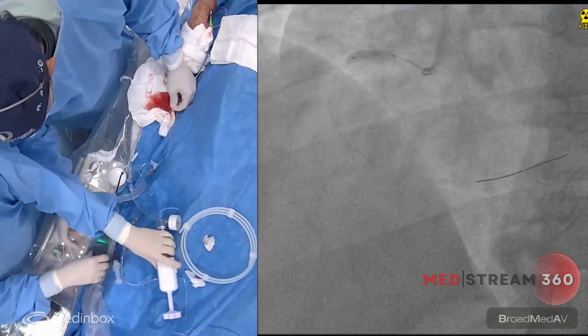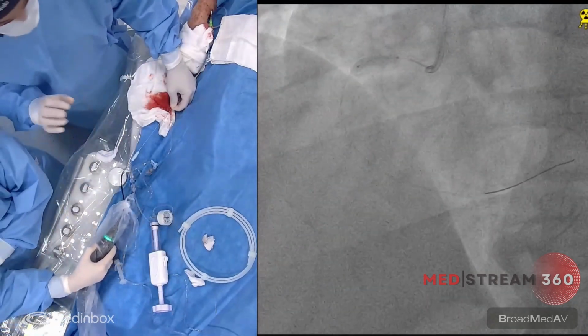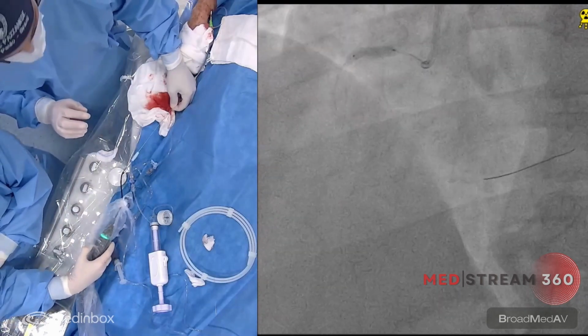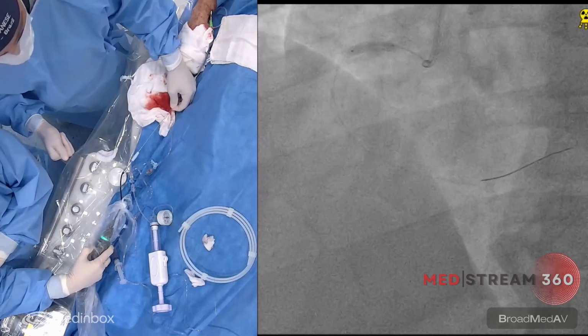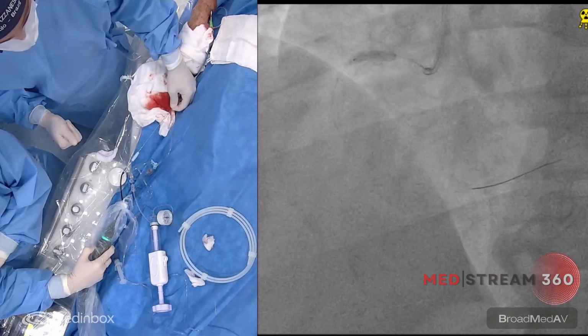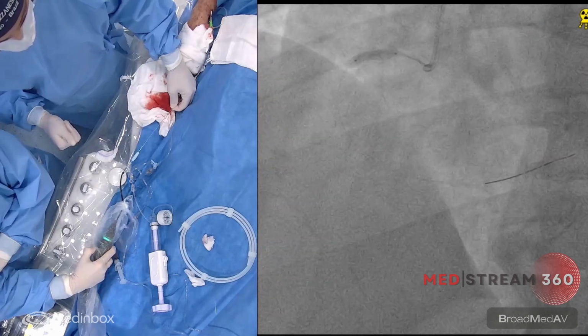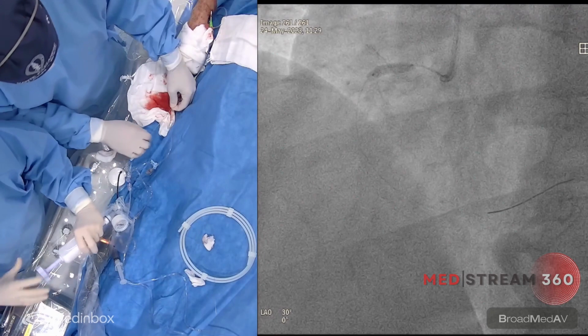4 atm. You inflate the balloon, just. The proximal position is not perfect. Yes. But it's the maximal. So you're going to do the shockwave thing, right? You good? So you're a little bit proximal to the tight lesion. The tight portion of the lesion, I would say that. And we could see you have some difficulty to cross.